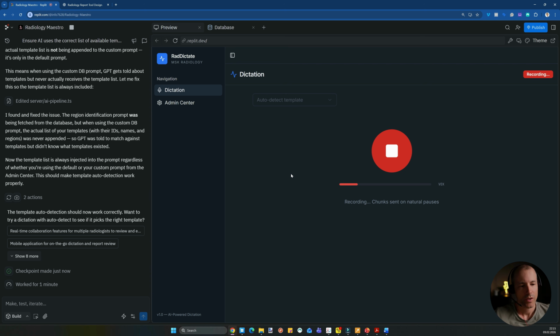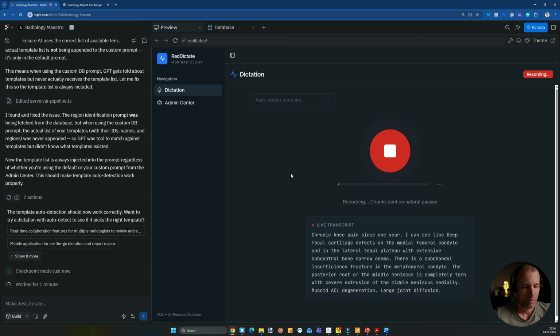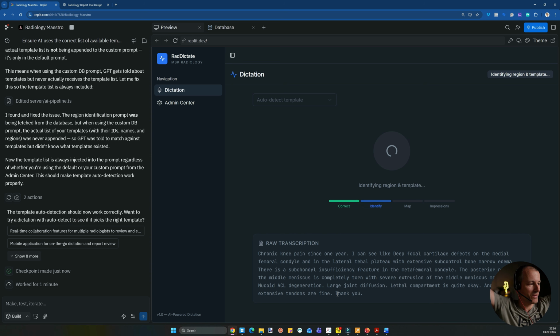Chronic knee pain since 1 year. I can see deep focal cartilage defects on the medial femoral condyle and in the lateral tibial plateau with extensive subchondral bone marrow edema. There is a subchondral insufficiency fracture in the medial femoral condyle. The posterior root of the medial meniscus is completely torn with severe extrusion of the medial meniscus medially. Mucoid ACL degeneration, large joint effusion. Lateral compartment is quite okay, and the extensor tendons are fine. Thank you. So it's quite nice. Lateral compartment. Okay. Now let's see if this is actually working.